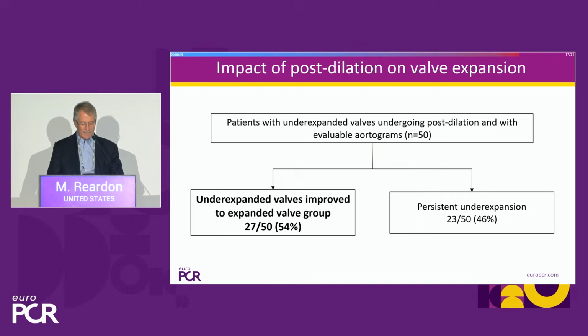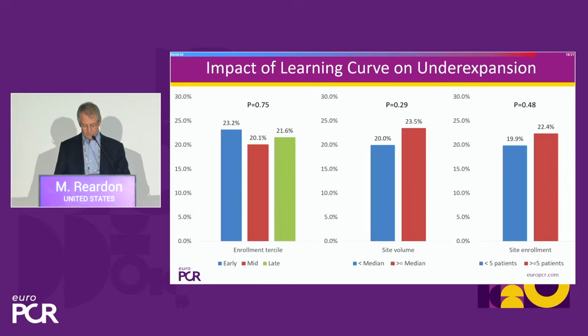As for the impact of post-dilatation, of the underexpanded valves undergoing post-dilatation, about half improved and half of them didn't improve. And I don't really know if that's because we weren't expanding them enough, because we really weren't recognizing this. This is just what was done in the trial.